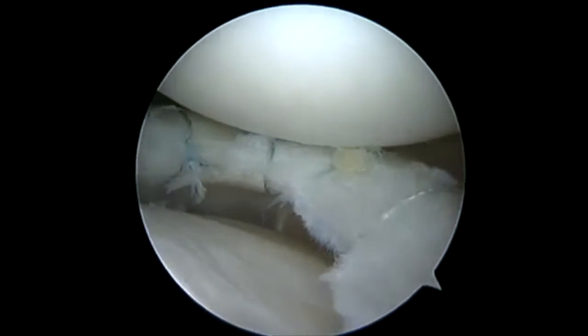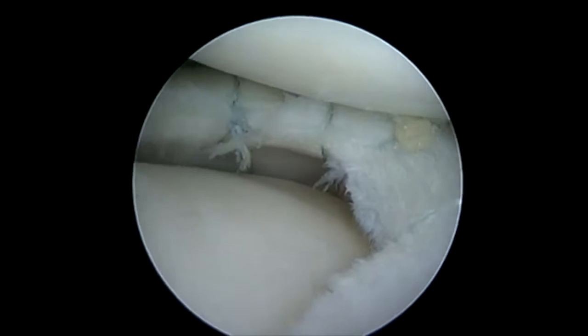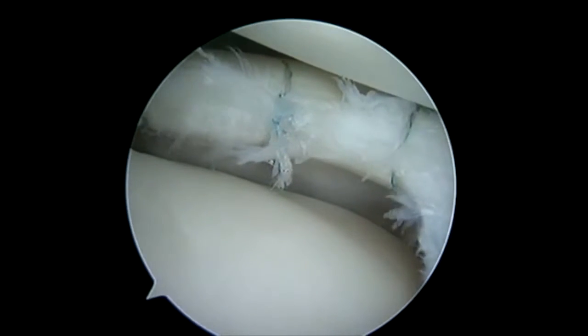Here we've completed our lateral repair. You can see that anterior horn stitch. You can see how we go around to the posterior horn, and we've got a nice repair of this lateral meniscus.